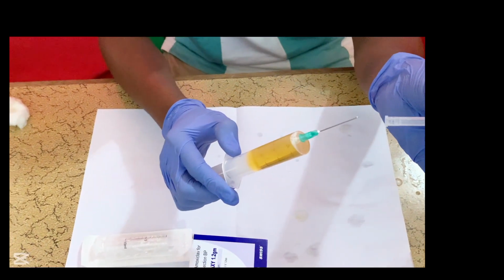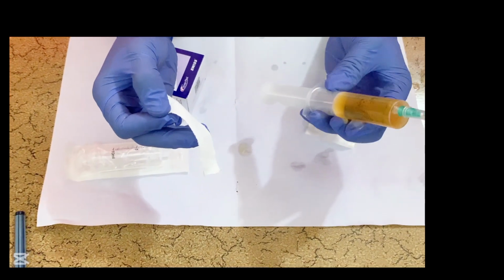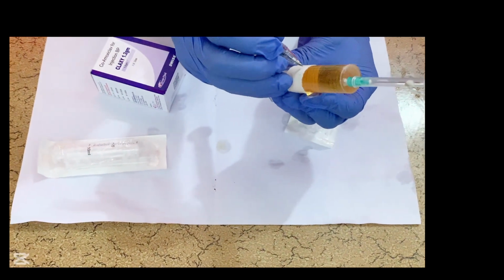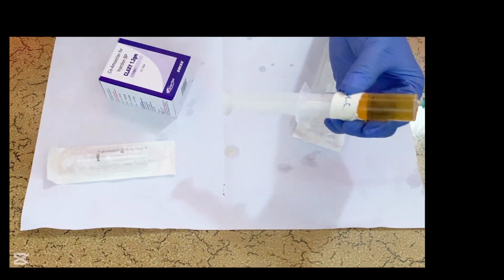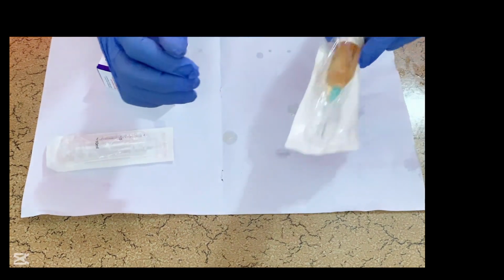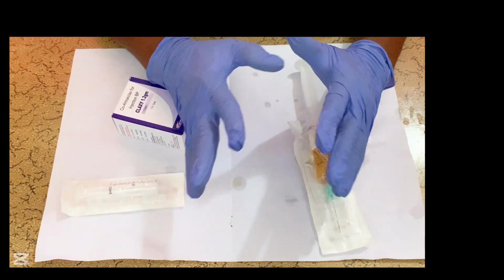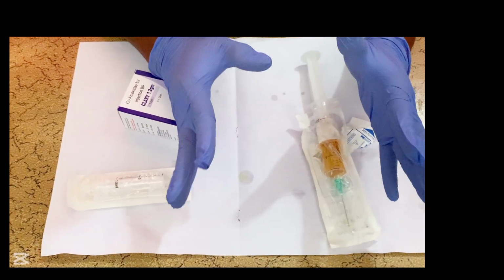Then you put back the cap of the needle. When you finish diluting the drug, make sure you label the drug. Then you put the syringe back into the packaging to maintain the sterility of the drug. Then you go to the patient's documentation and make sure that you follow the 8 rights of drug administration. That is the right patient, right drug, right dose, right route, right time, right reason, and the right documentation.